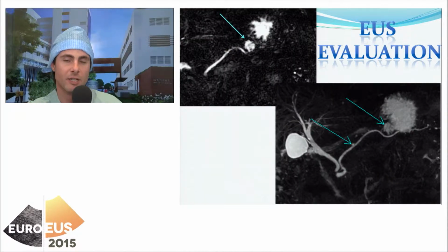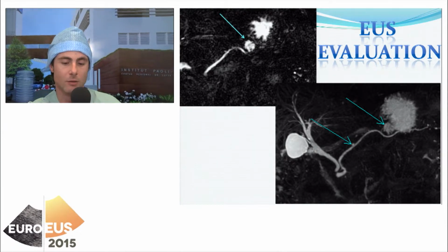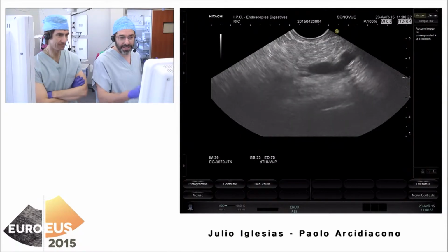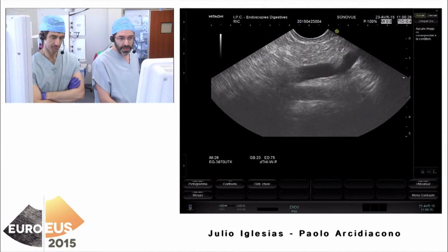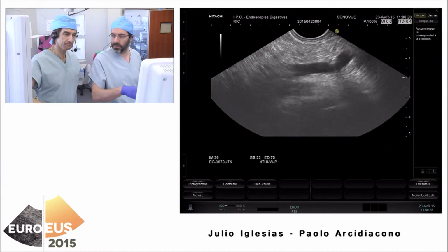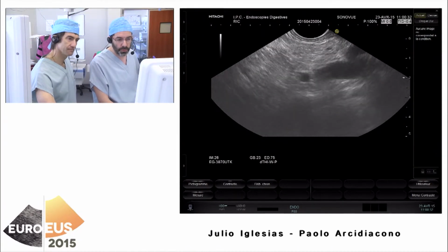And the patient is scheduled today for EUS evaluation with Dr. Iglesias and Dr. Archidiacono. We are just with the scope taking a look at the body of the pancreas. We've already gone through the case and we will focus on what we found, because it's very interesting.